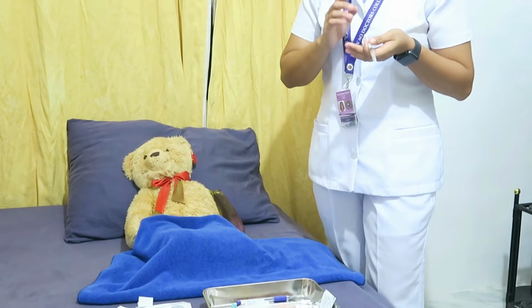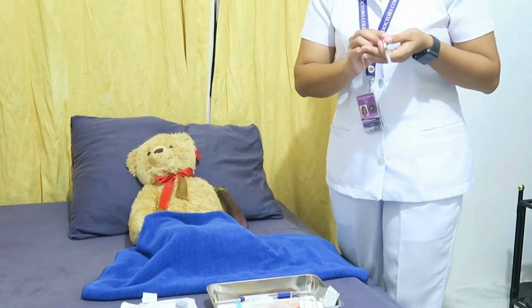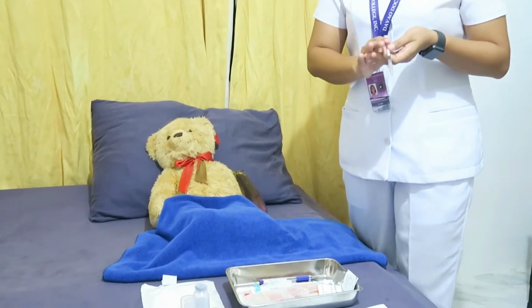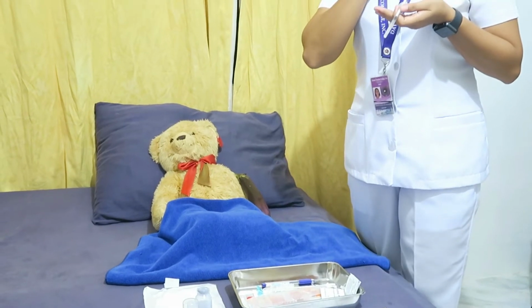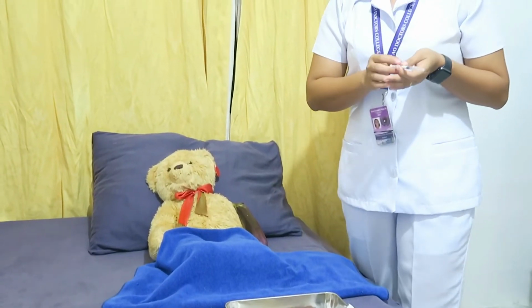Apply gloves as indicated by agency policy. Cleanse the skin of the site using a firm circular motion. As you can see, I've already cleaned the site in a circular motion, starting at the center and widening the circle outward. Allow the area to dry thoroughly. Then prepare the syringe for the injection. Before that, remove the needle cap.